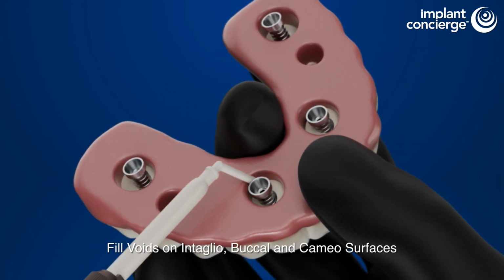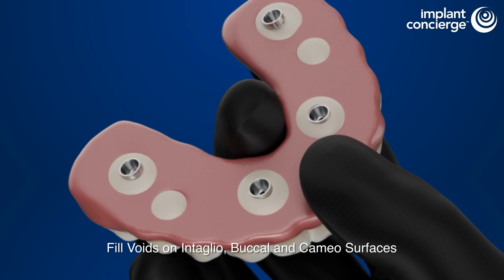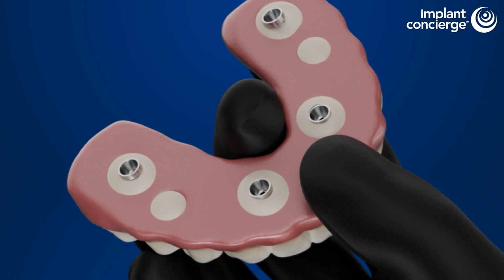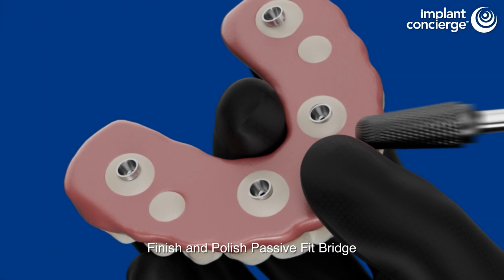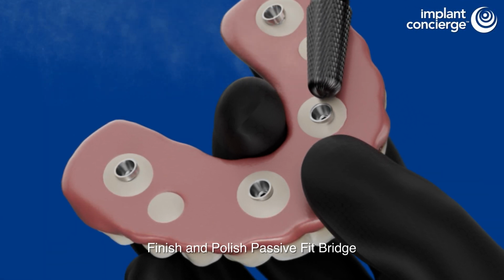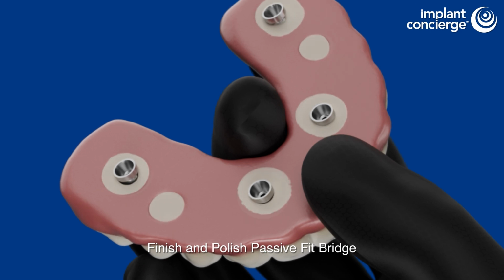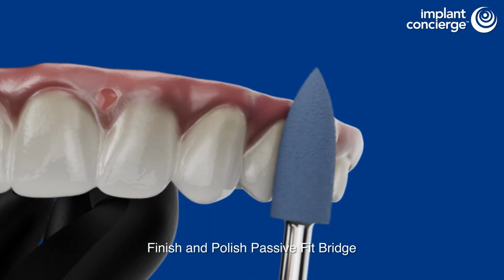Inspect the passive fit bridge for voids on the intaglio, buccal, and cameo surfaces. If present, fill it with luting material of choice and cure. Remove bulk material with a carbide burr. Use a coarse rubber point for smoothing. Achieve your desired finish using a fine rubber point or a wheel to polish all surfaces.